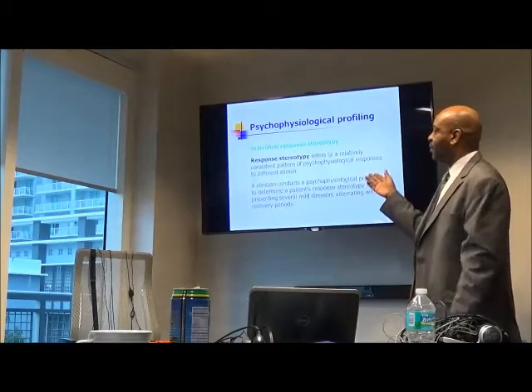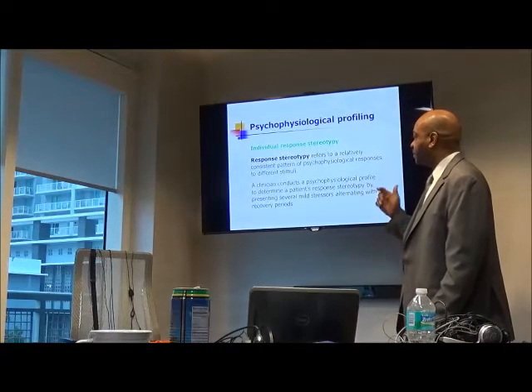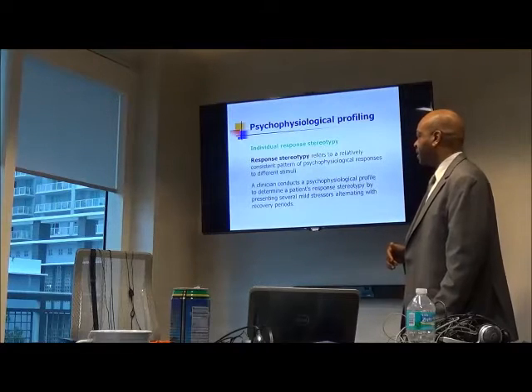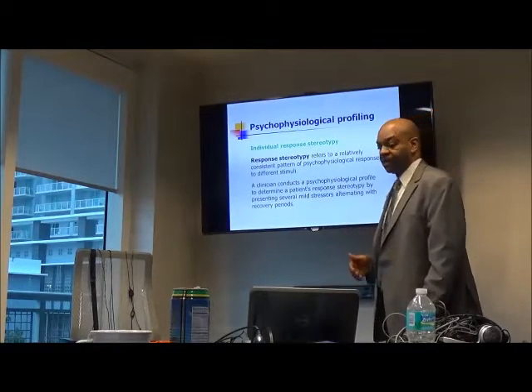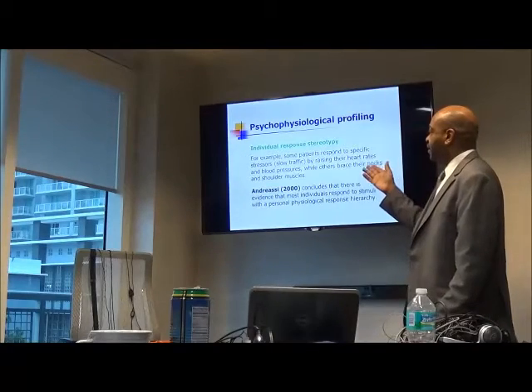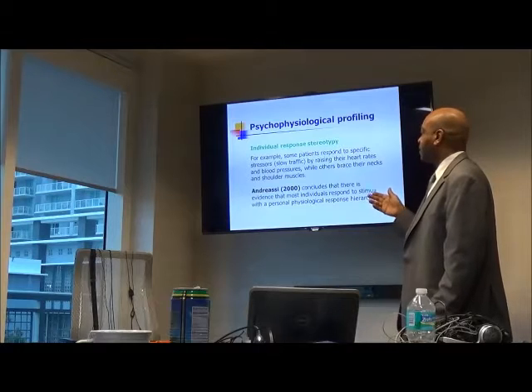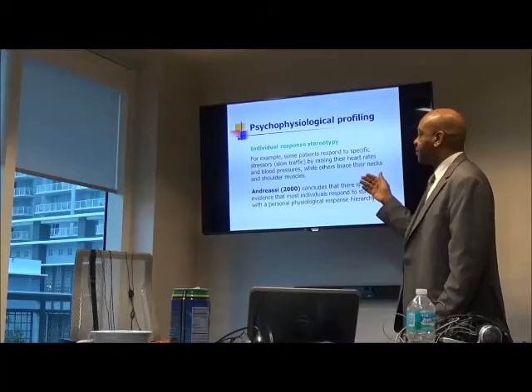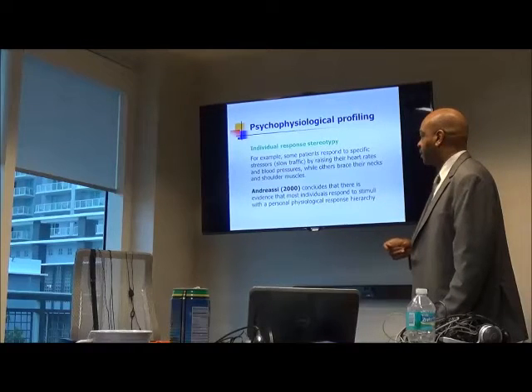And as I said before, you get to see how the person responds, which modalities tend to respond more to stressors, and how they recover. So you might have some people that respond more to something that another one doesn't. Someone may have changes in their heart rate and blood pressure, another one has tension in their upper back and their neck.